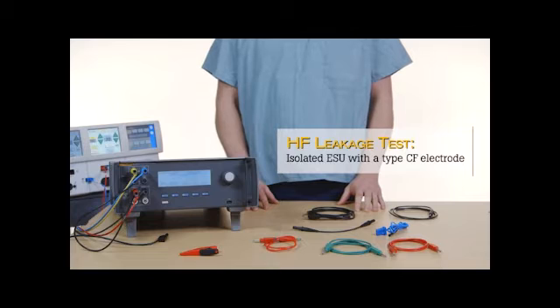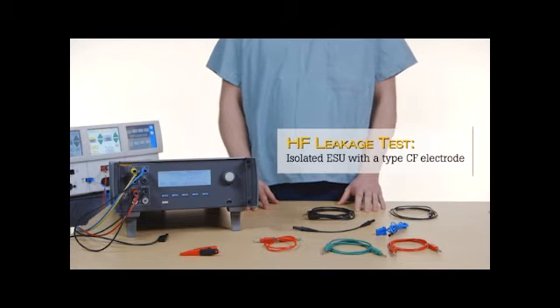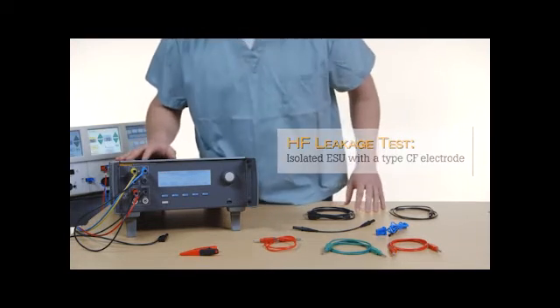Here's how to do an HF leakage test for an isolated ESU with a type CF, active to earth, electrode.